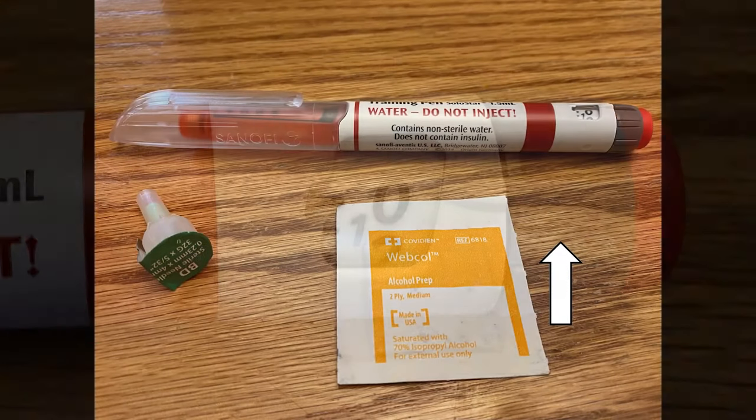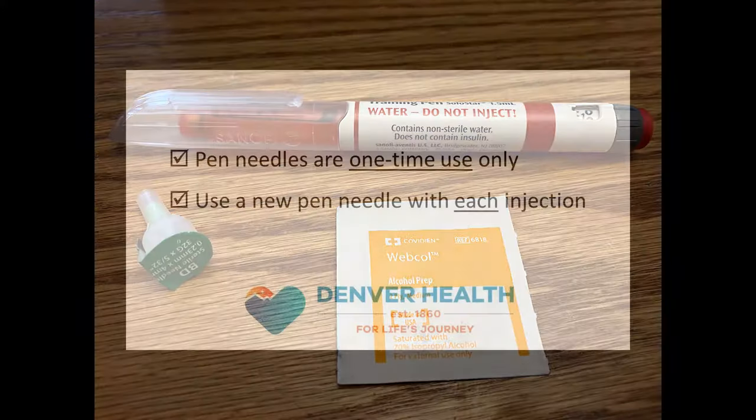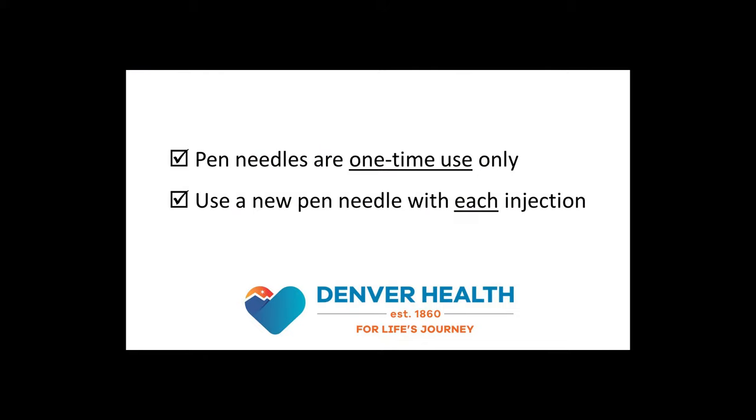Now let's gather up all the supplies we'll need. You'll need an alcohol wipe, your insulin pen, and a new pen needle. Remember, pen needles are designed for one-time use only, so every time you inject insulin, you should be using a fresh pen needle.